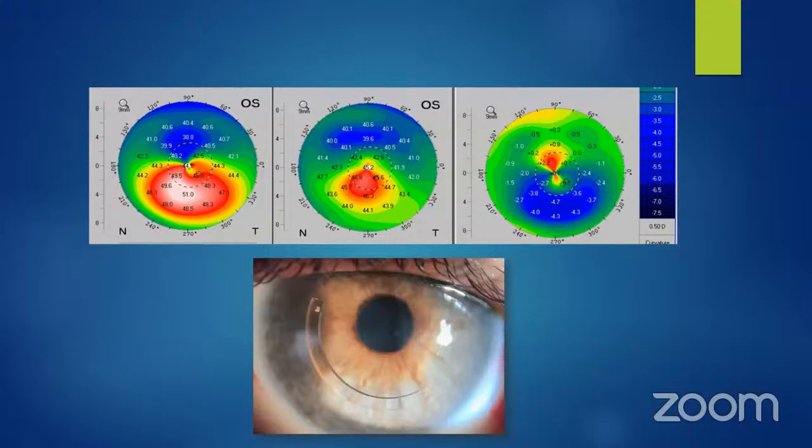What is this here? Intracorneal ring segment. Yes. Okay. So intracorneal ring segments, a single segment put in the area of the ectasia, would cause a flattening. Quite sometimes these are coupled with CXL before or after, so that the cornea becomes much more amenable to a contact lens fitting later.